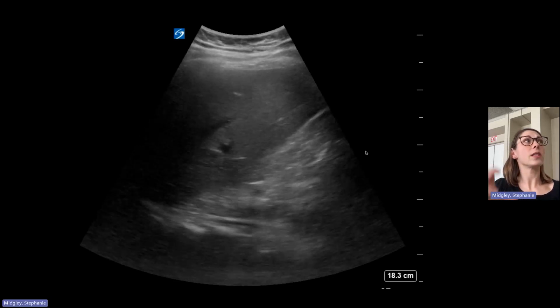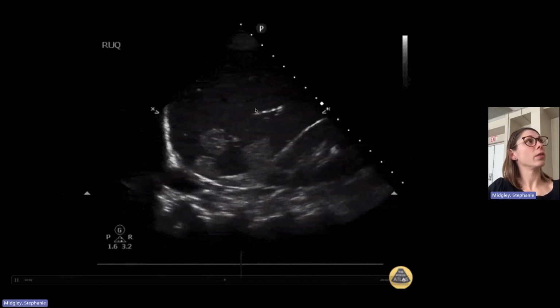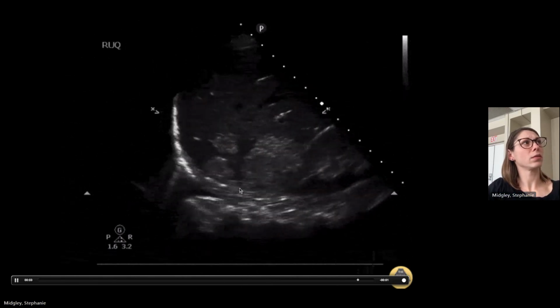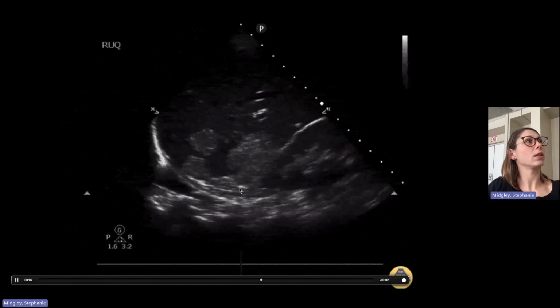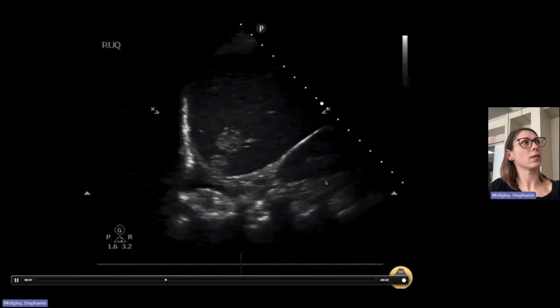That's a hemangioma. So a cyst was anechoic, right? And hemangiomas are always going to be hyperechoic. What would be some of the differentials for hemangiomas? So this is the most common benign liver lesion. Mets. Yeah, so Mets can be both hyperechoic or anechoic. So this is Mets, but what do you notice different about this one, like this hemangioma versus these Mets?